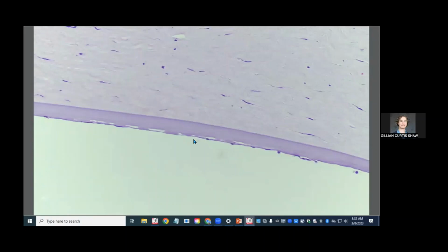That term is a fun name. If you're speaking Latin languages, recognize gutta as like gota, a drop. So those are like tiny drops. And many gotae, gutta, or guttata, so multiple drops in the Descemet's membrane. Makes it easier to remember.